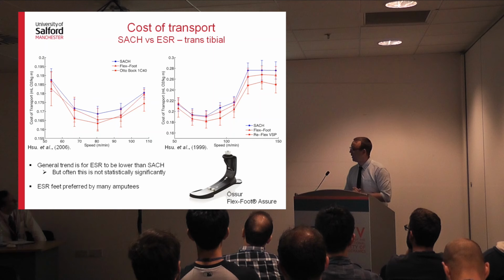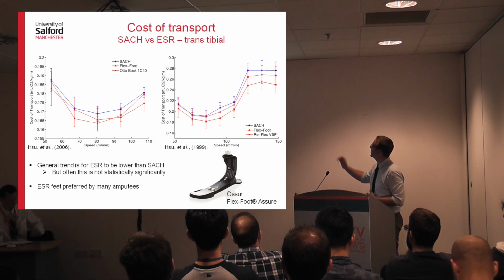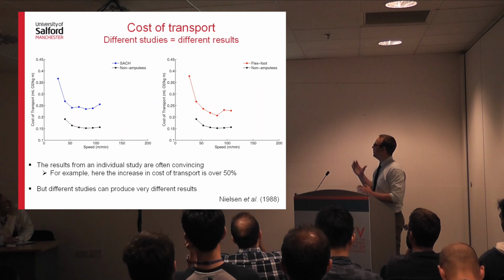On the graph on the right, you can also see some running data there, which is unusual to have amputees running with a walking foot, but there's some data there on it as well. Okay, carrying on. So that was comparing different feet and showing individual studies.